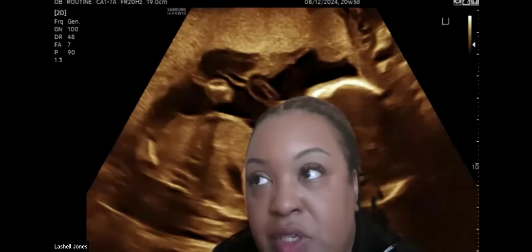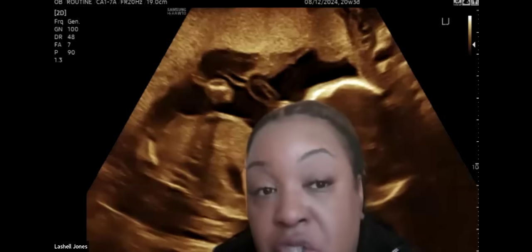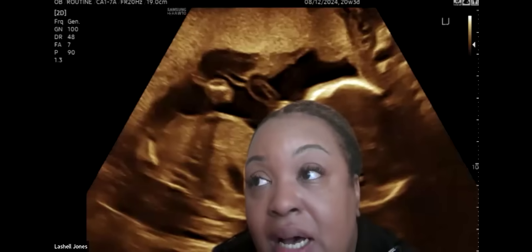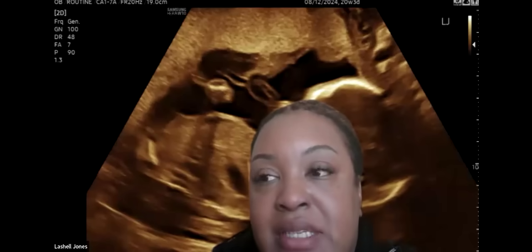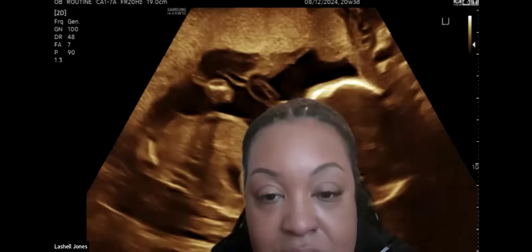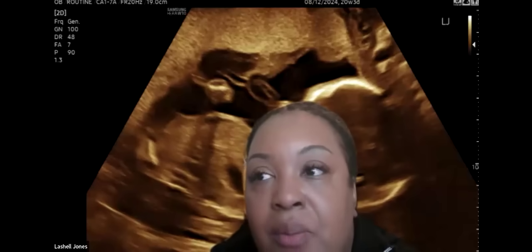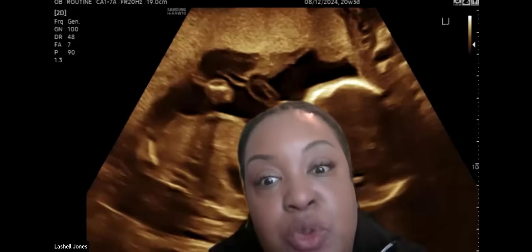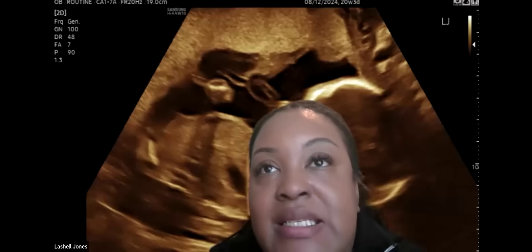Going back, even in that particular case, I think maybe it was a subtle sign on the ultrasound that possibly was missed, unfortunately. I didn't get to go back and look, but maybe there was renal pyelectasis or echogenic bowel that, especially if it resolved, you think, oh, it's fine, but maybe those were clues to look further or even offer the testing.